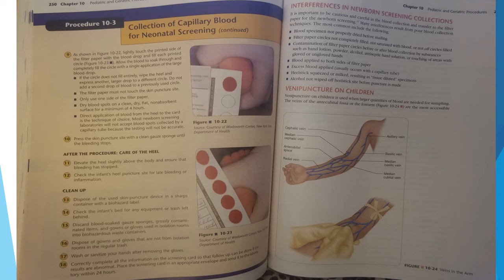Interferences in newborn screening collections. It is important to be cautious and careful in blood collection and transfer to the filter paper for newborn screening. Many interferences result from poor blood collection techniques. The most common include the following: blood specimen not properly dried before mailing, filter paper circles not completely filled, not saturated with blood, or not all circles filled, contamination of filter paper circles before or after blood collection by substances such as hand lotion, powder, alcohol, antiseptic hand solution, or touching areas with gloved or ungloved hands.